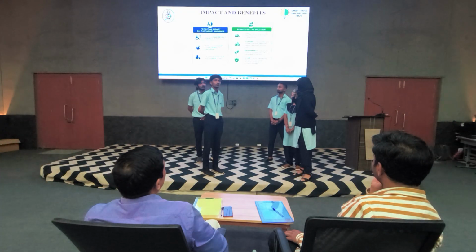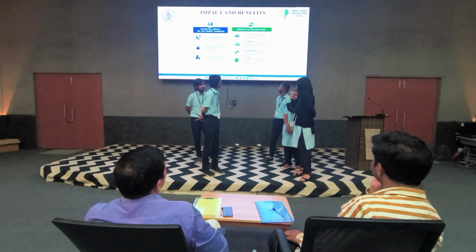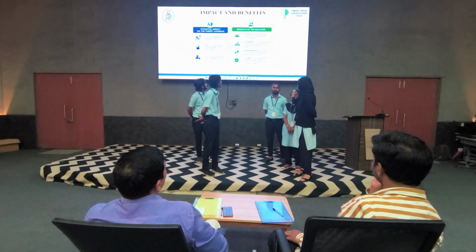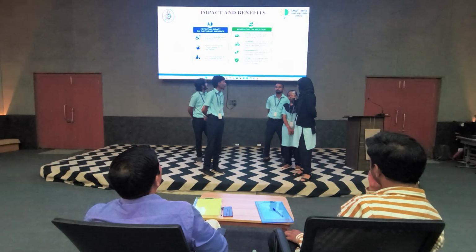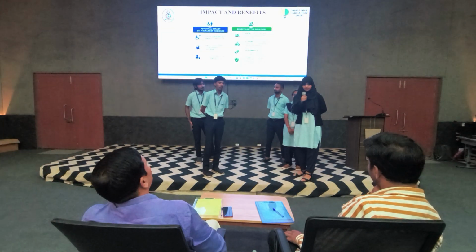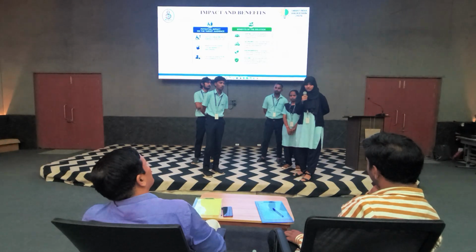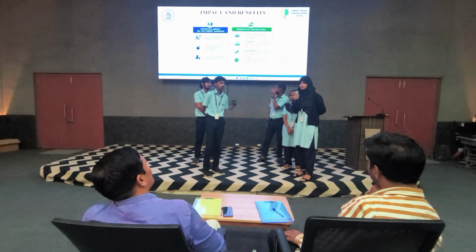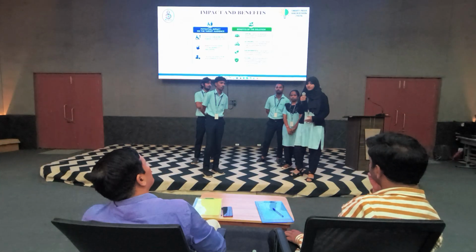The benefits of our solution are social, economic, environmental, and future. In social, there is better accessibility and inclusion for people with limited mobility. Economic: we are making it low cost, because at present there are very high cost features. We want our patients or any of our customers to get what they want at a budget friendly price.